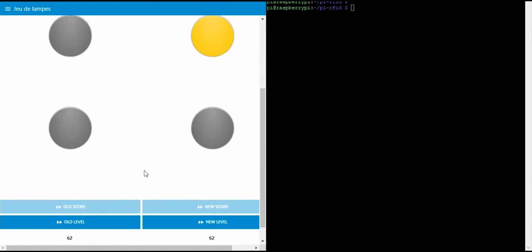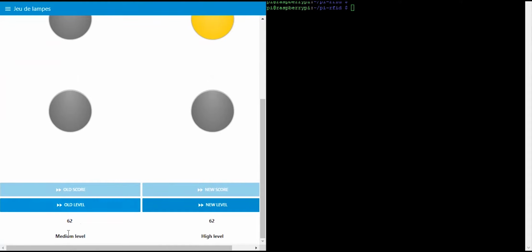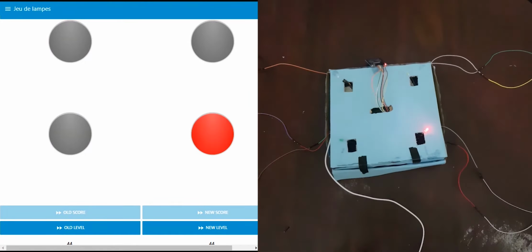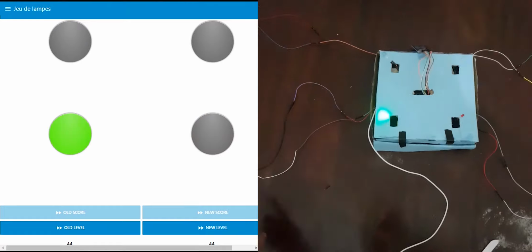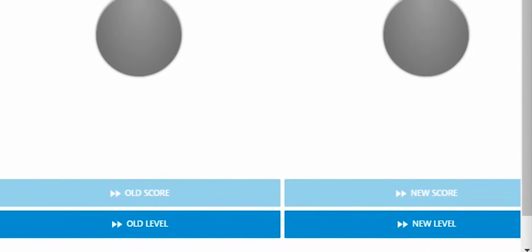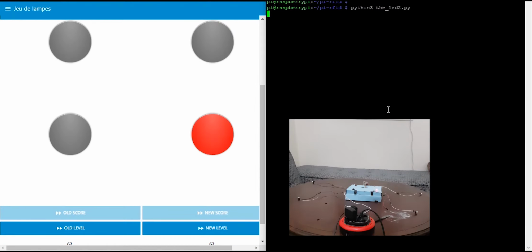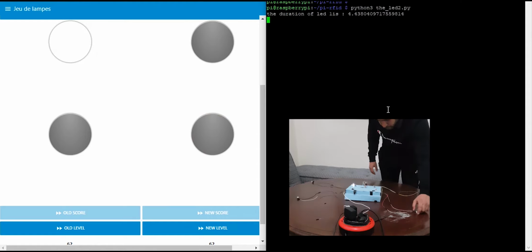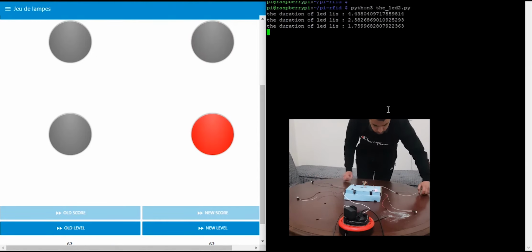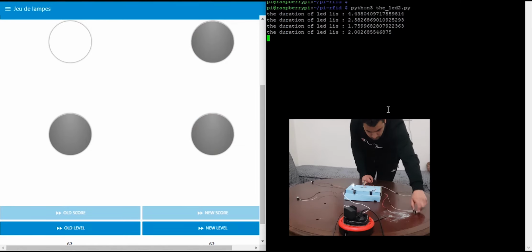Node-RED provides us with this beautiful UI interface, where we can see all the components that were built in the node map. Here, for example, we can see the 4 LEDs. When the program runs, the LEDs take different colors depending on the LED true color. And here we have a message that tells the level and the game score. Here, for example, let's take a healthy person case. Of course, a healthy patient will pass the test easily. At least, he will pass the first test and the second one.